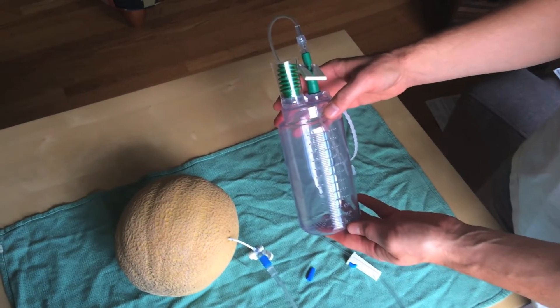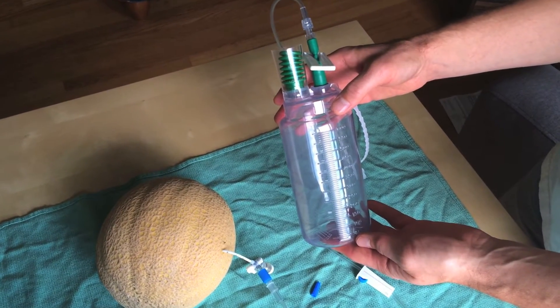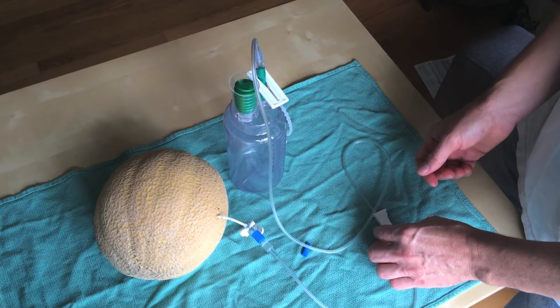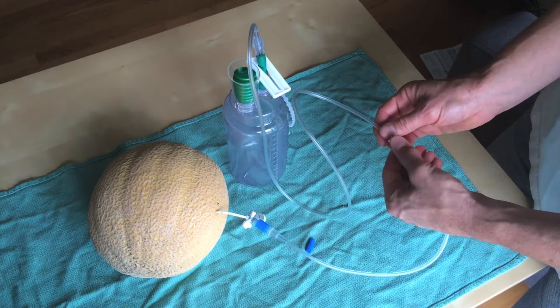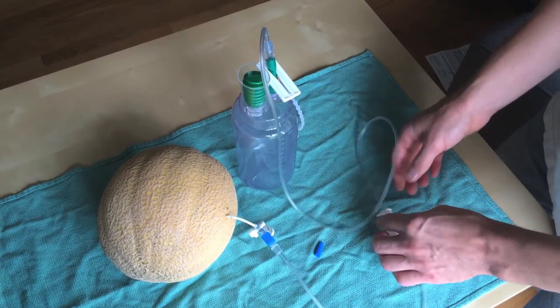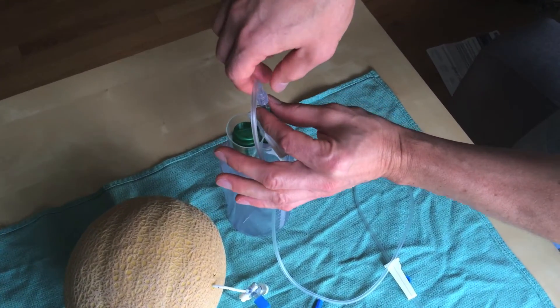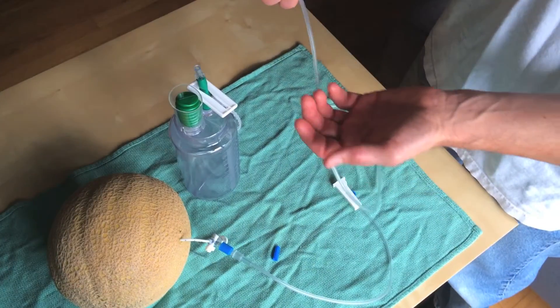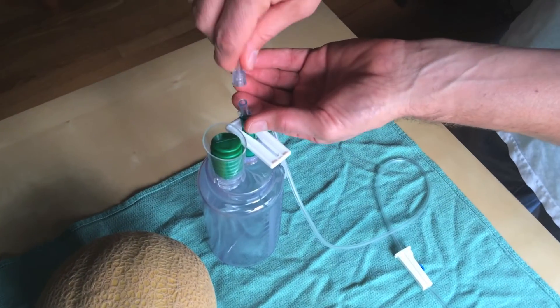Each bottle holds 600 ml and costs $27. If further drainage is needed, clamp the tubing and disconnect the full bottle at the luer lock at the top of the bottle. You can then reconnect a fresh bottle using the tubing you've left in place.